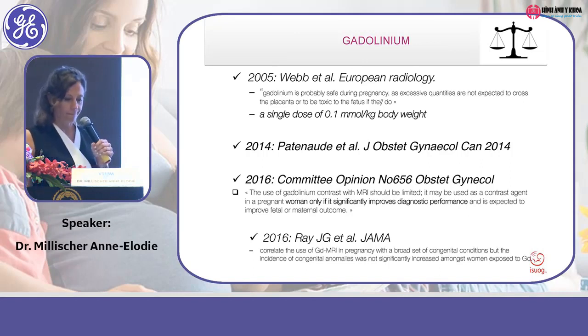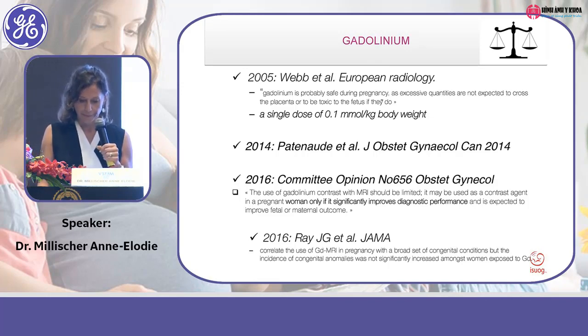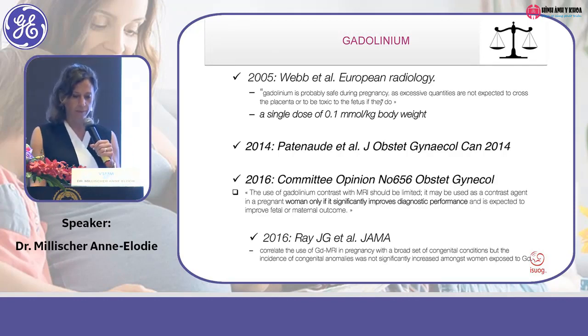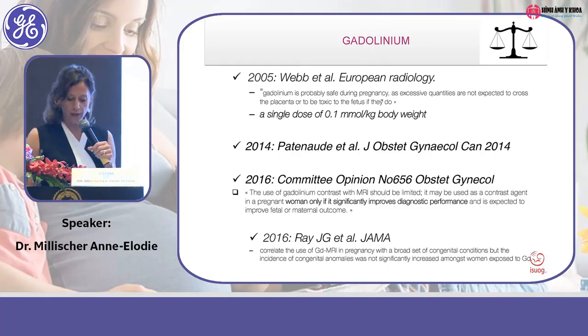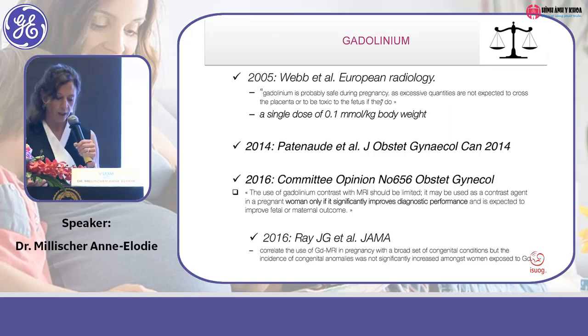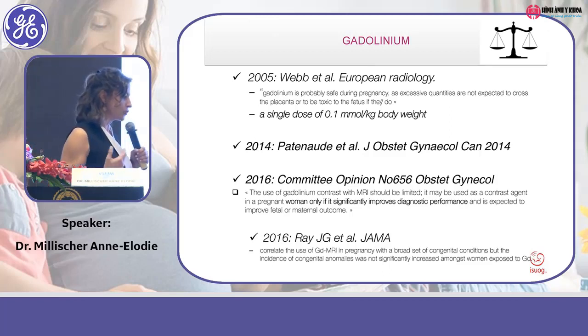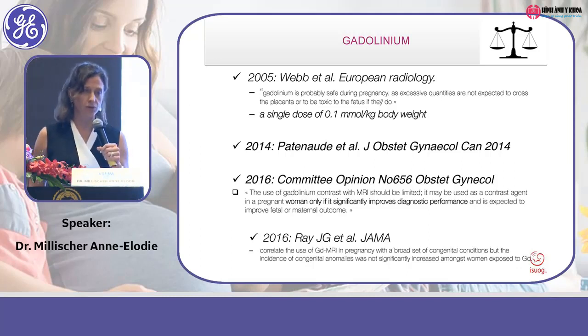Và khi mình khảo sát một cái nghiên cứu trên những cái bác sĩ mà mới làm về cái bệnh lý này thôi, thì mình thấy là khi mình tiêm thuốc vô thì cái khả năng chẩn đoán chính xác của những cái bác sĩ mới này nó sẽ tăng cao, gần tương đương với lại những bác sĩ mà đã lâu rồi. But the use of contrast during pregnancy is questionable, so we have to do a balance between the risk to do contrast in a pregnancy and the risk for the mother to have a placenta accreta.